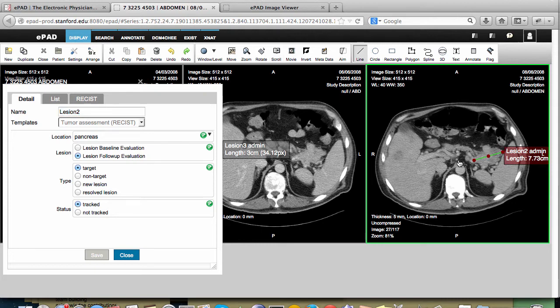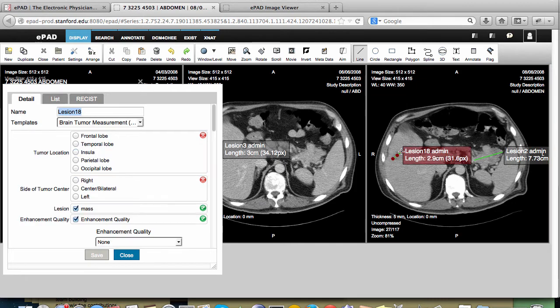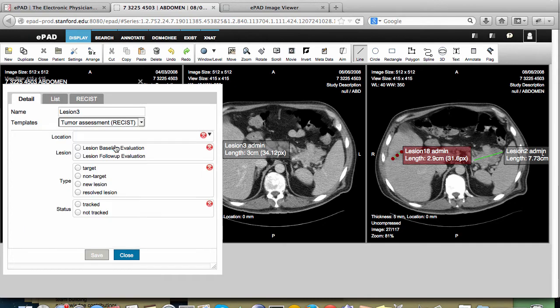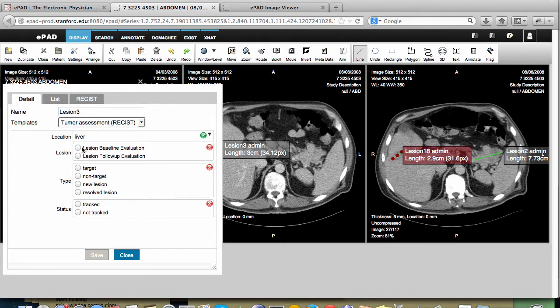It's easy to measure the third lesion. We simply draw a line. We give the lesion the correct name — we're going to call this lesion 3. We pick the template that we're using, which is RECIST. We need to say where the lesion is, the location. This is a follow-up, it's a target image and we're tracking it. And then we save it.